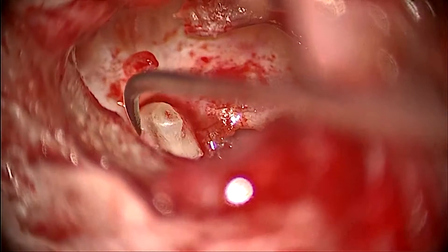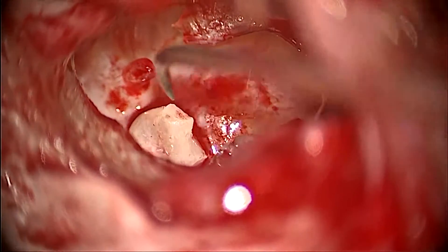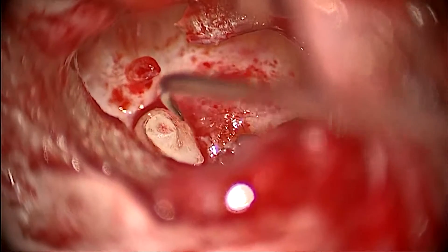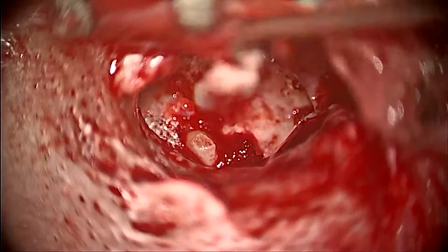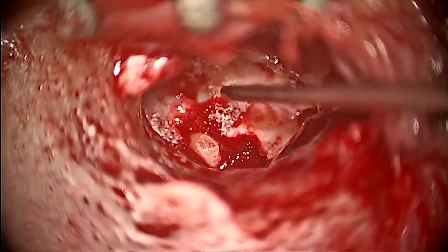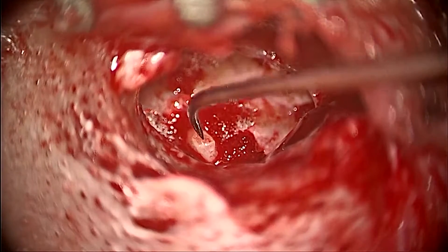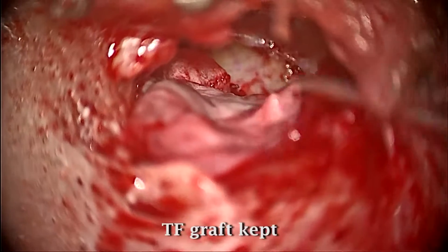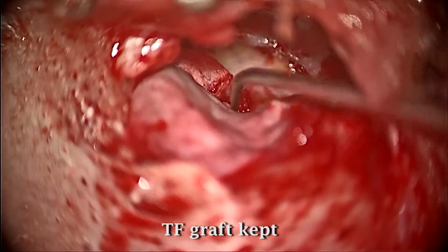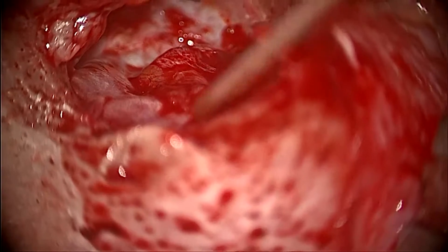Grafting of the tympanic membrane was then taken up. Gel foam was kept around the incus to increase its stability. Temporalis fascia was used to graft the tympanic membrane.